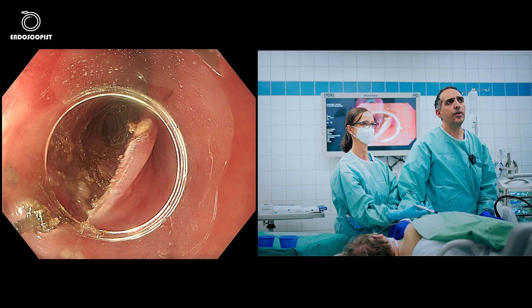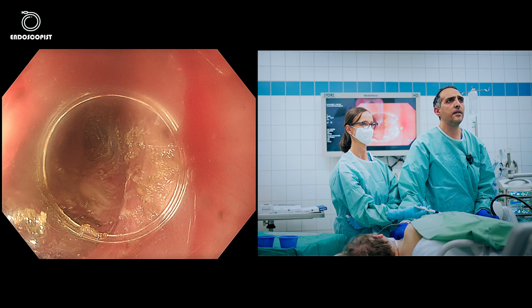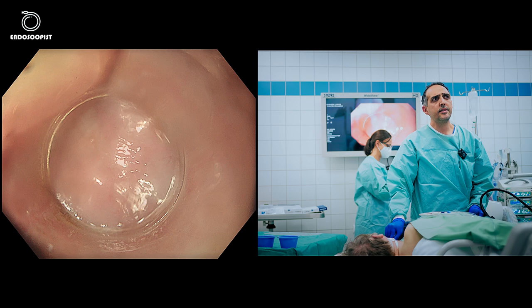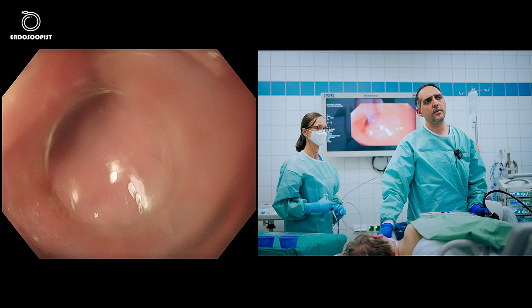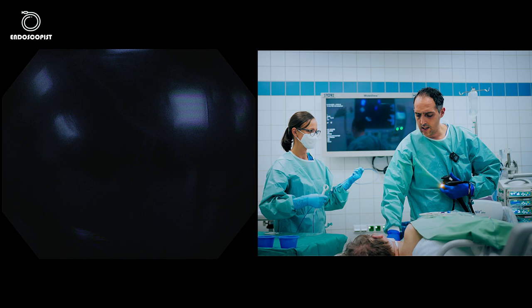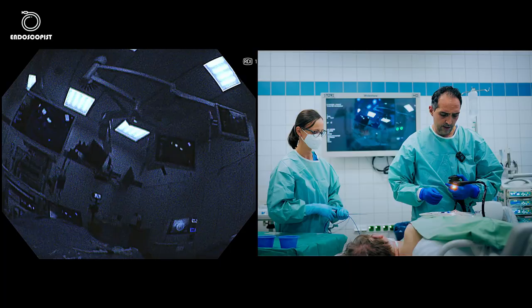We'll now close the tunnel opening with a few clips. We can still see the sack or pouch of the mucosa — Z-POEM would be criticized for leaving this pouch after performing the myotomy. However, all our experience and published data show that patients don't have problems. Theoretically, the pouch may cause some long-term regurgitation, but from our experience and the published data, no problems have been encountered with this remnant pouch.